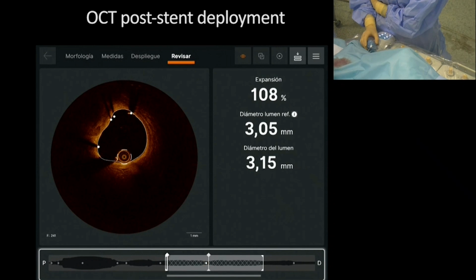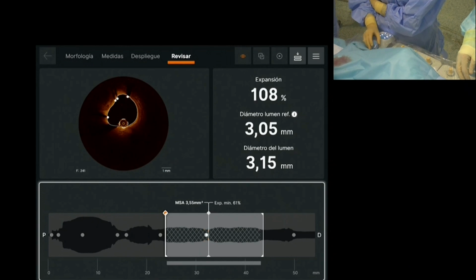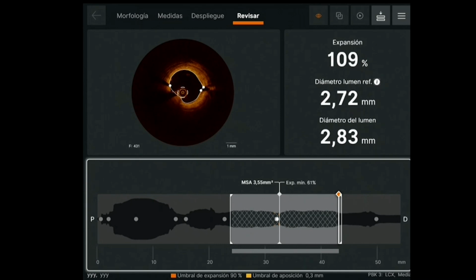And now let's apply the MAX part of the algorithm. So you can see the lumen profile, and here the lumen profile is indicating where the minimum stent area is located. You can see that actually here the system had some problems in really detecting the real luminal area, and this is probably related to the shape of the stent in this area created by the calcification. You can see that the stent looks quite eccentric at this level. But you can see that proximal and distal to that, the system has properly detected the lumen, and you can see that the expansion is actually really good.